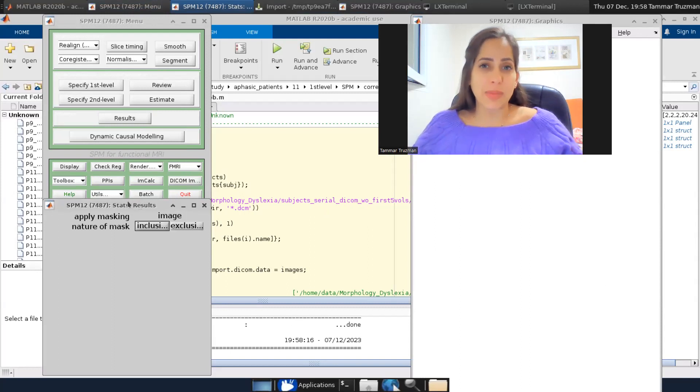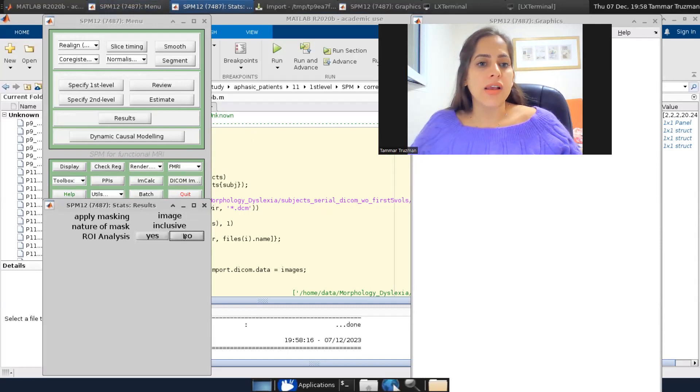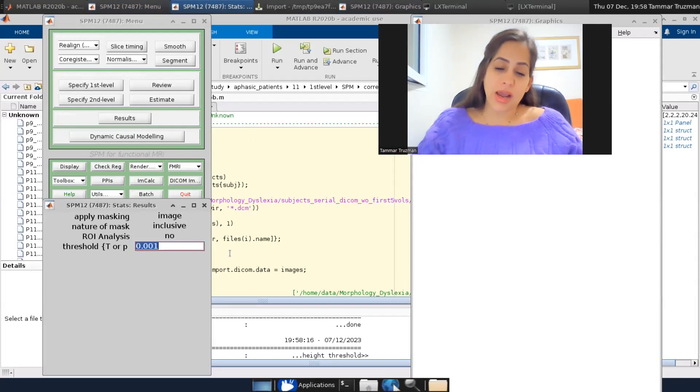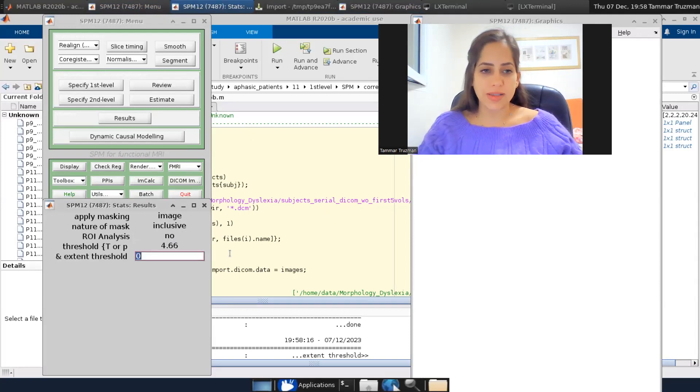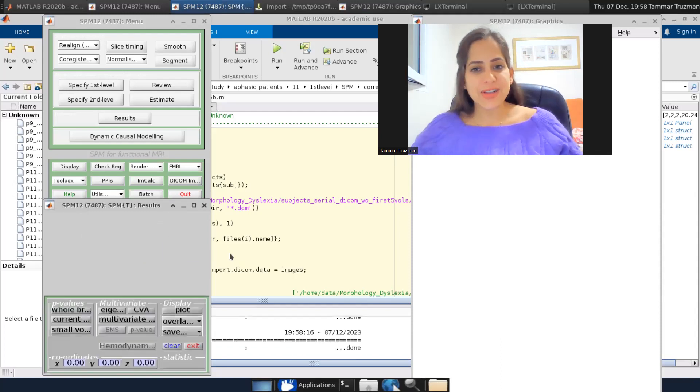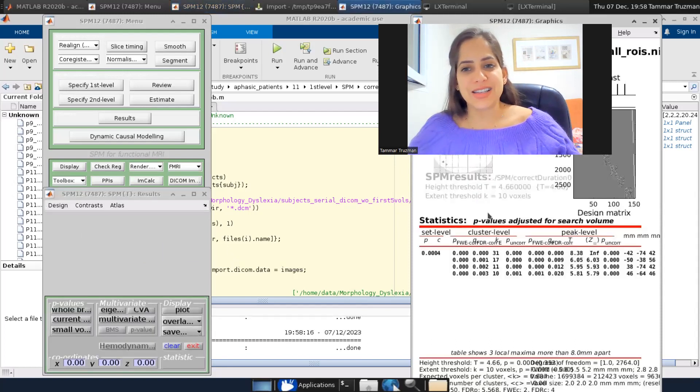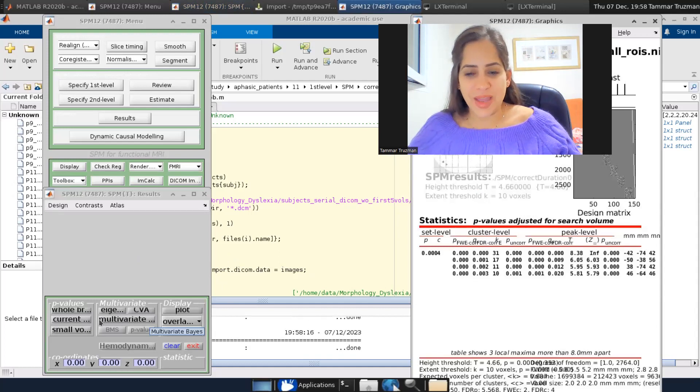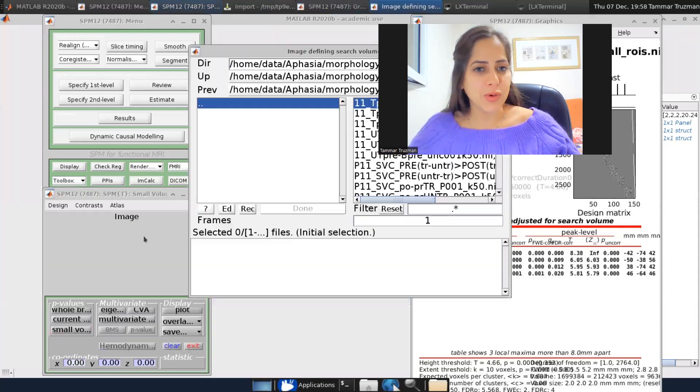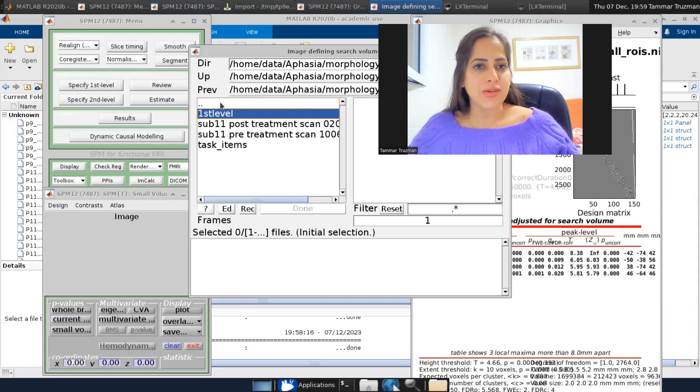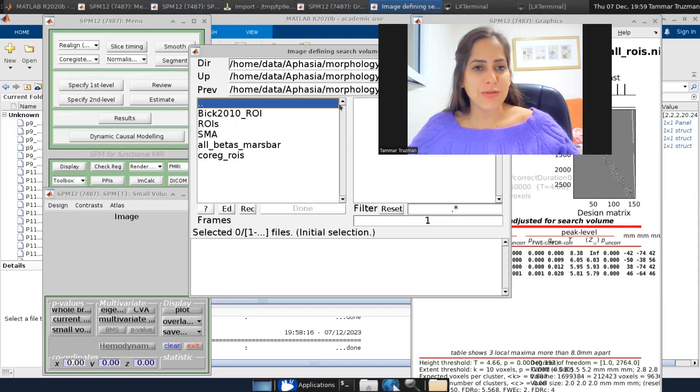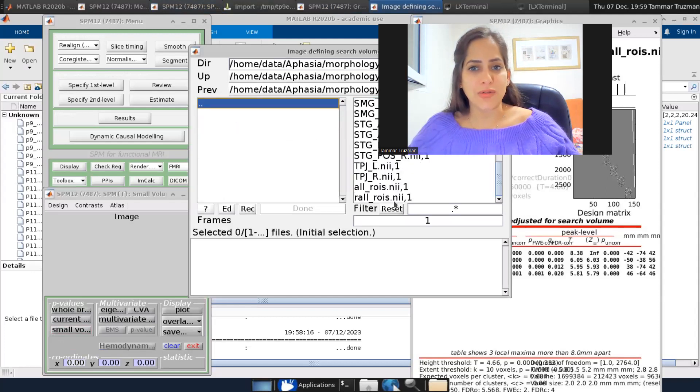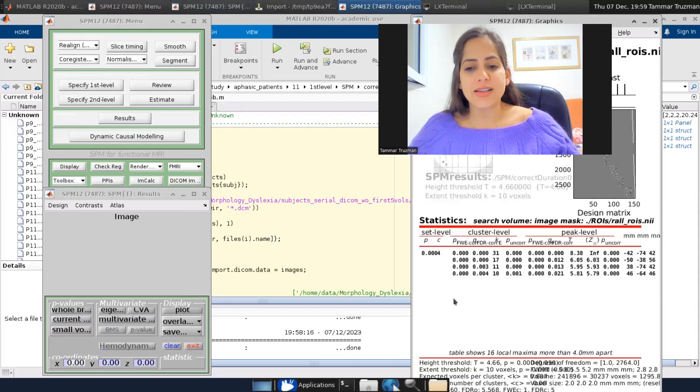And after I applied small volume correction, it also doesn't make sense to look at these voxels, right? And I'll choose, now I know the high threshold T equals 4.66 and 10 voxels. And now I applied a small volume correction as we did before. So I'm correcting only for the voxels within our VOI. And now we are done.